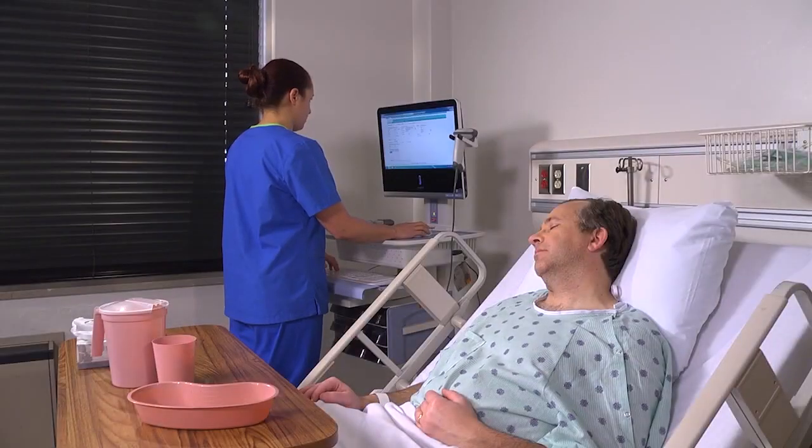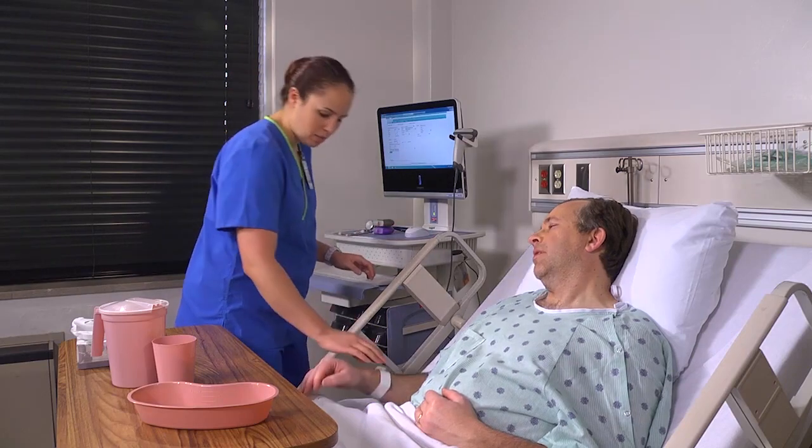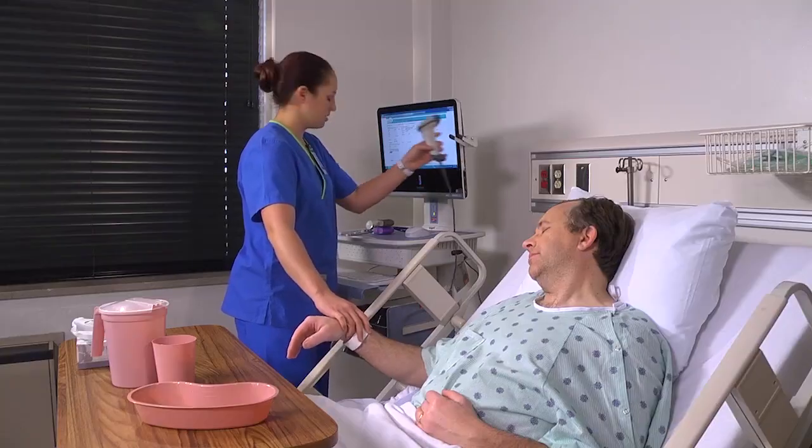Perform hand hygiene and ensure privacy. Verify the patient's identity using 2 identifiers. Can you tell me your name and birthday, please? Warren Hildebrand, 4/5 of 68. Okay.